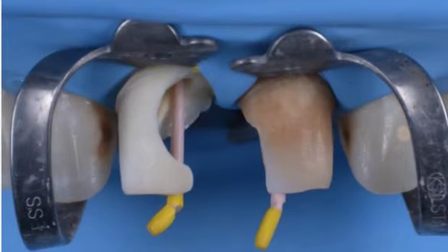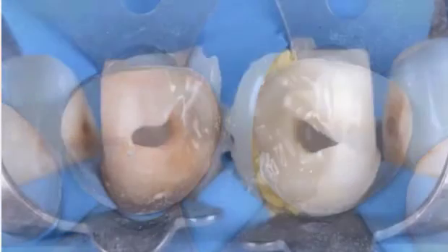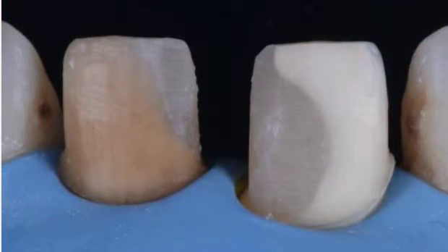Some pictures from the obturation sequence. All is clean, core build-ups, and the preparation. I pay your attention to the mesial part of the central incisor. You can see a real deep margin, and this deep margin was secured and prepped to the tooth being isolated. How it was, we will see on the video.